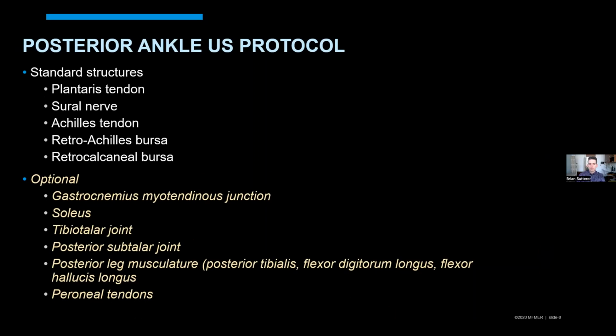Another image in my protocol is soleus, and it's a long axis of the soleus, because a low-lying soleus can present as a mass. There's debate whether it influences pain in this area. Even if my extended field of view shows a soleus, I'm fine, but looking at the distal soleus attachment is part of the protocol.